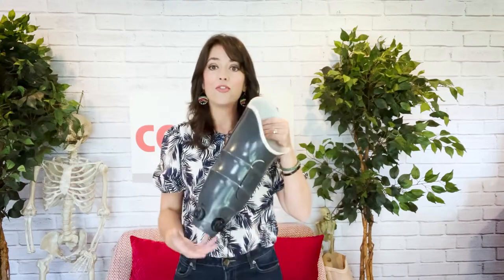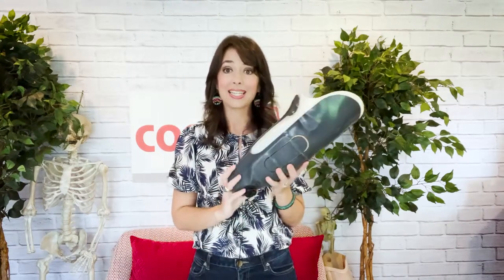Now as with everything else in the world of prosthetics, there are many different ways to create adjustability. So allow me to introduce the RevoFit adjustable system by Click Medical. With RevoFit you have three different ways that your prosthetist can accommodate your socket to allow for the changes in your limb throughout the day.